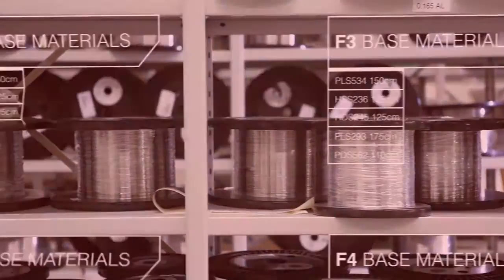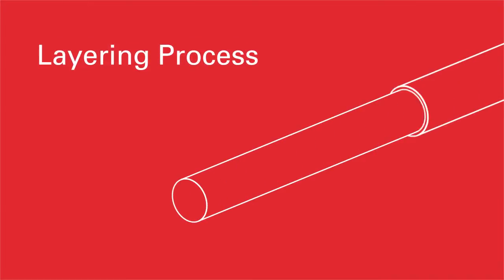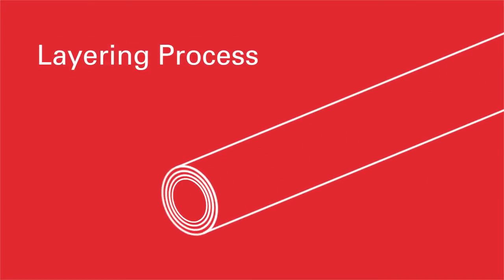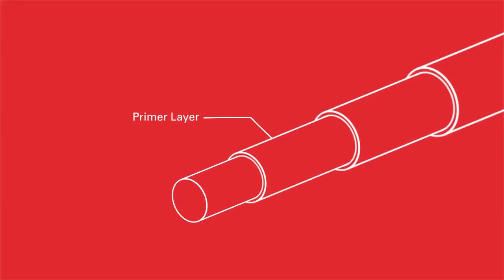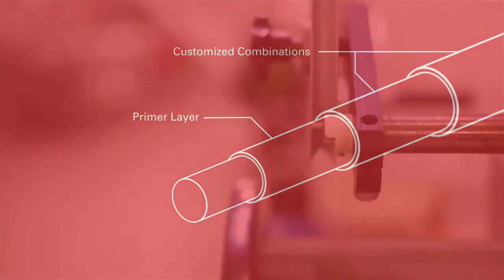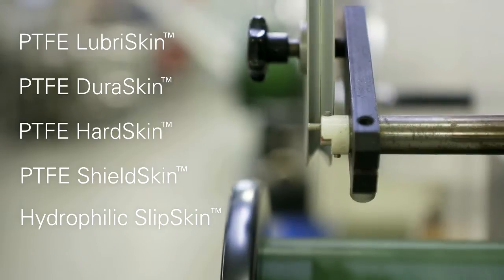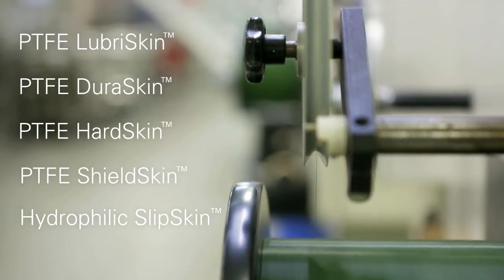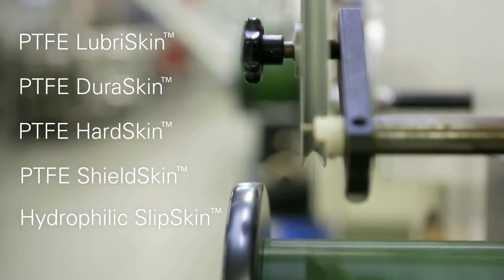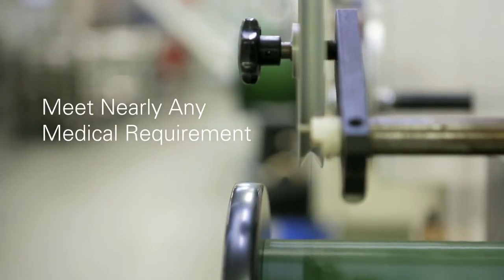At Merit, we also use a unique layering process to apply our coatings. This includes a primer layer followed by customized combinations of smooth, hard, tough, and flexible topcoat layers. This approach gives us the ability to meet nearly any medical requirements.